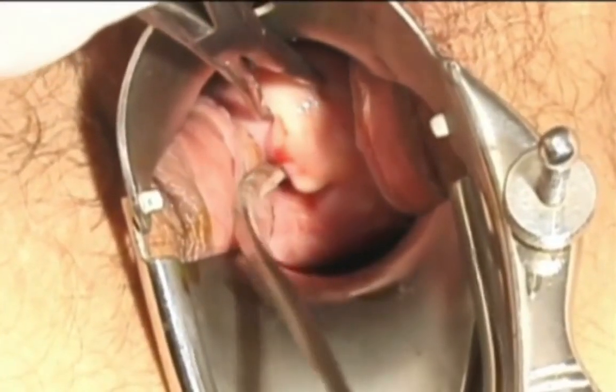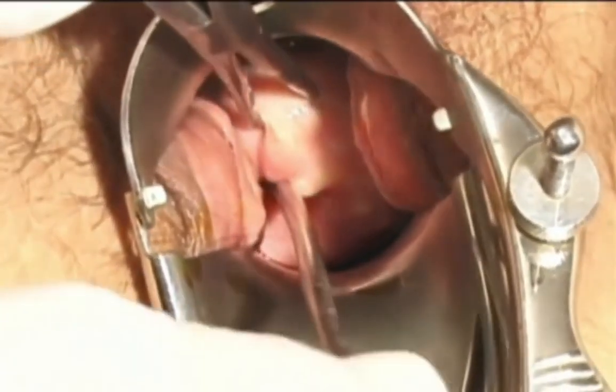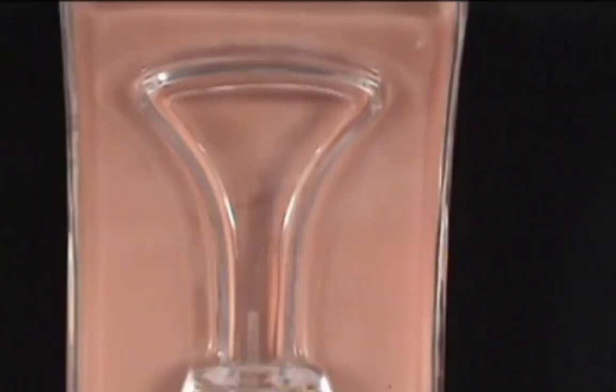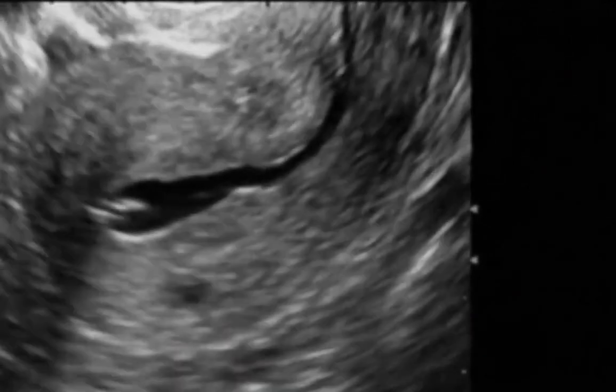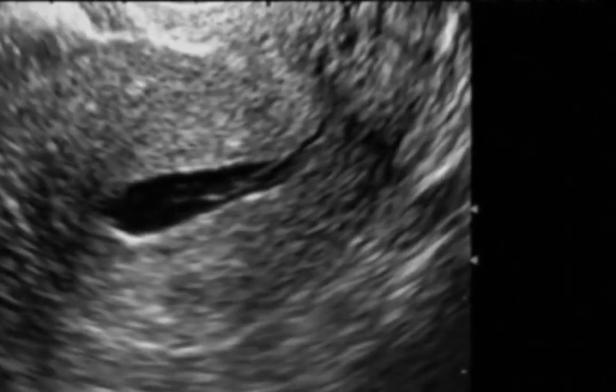Some physicians place topical or injectable anesthetic and use a tenaculum to stabilize the cervix, and then a sound to define the path for the catheter. After passing the catheter, saline is injected a little at a time while transvaginal scanning continues. Begin your evaluation with the lining. Each hemilining should be smooth, even, and consistent in thickness and texture.